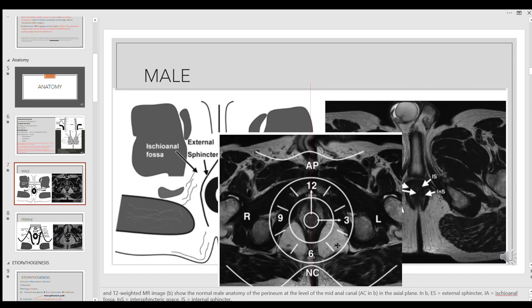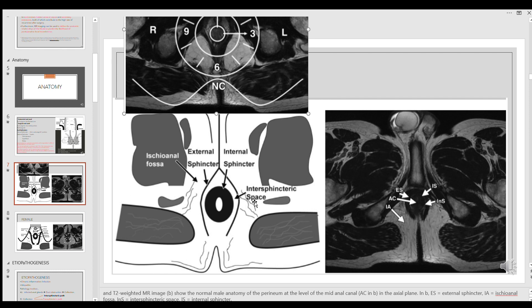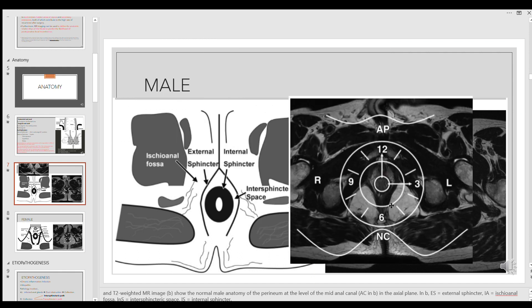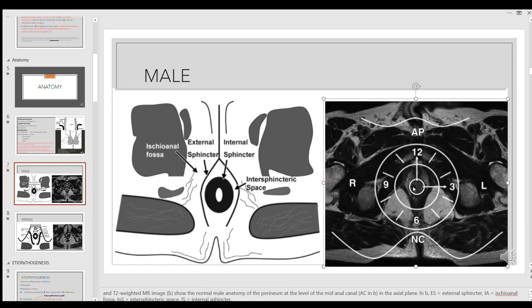On T2 axial non-fat-suppressed images, the dark structure represents the external sphincter. The wall of the anal canal represents the internal sphincter, and the intermediate signal between them represents the inter-sphincteric space. This is referred to as the anal clock, which you use to describe positions. Internal openings, track positions, and external openings are reported based on clock position: anteriorly is 12 o'clock, posteriorly is the natal cleft.